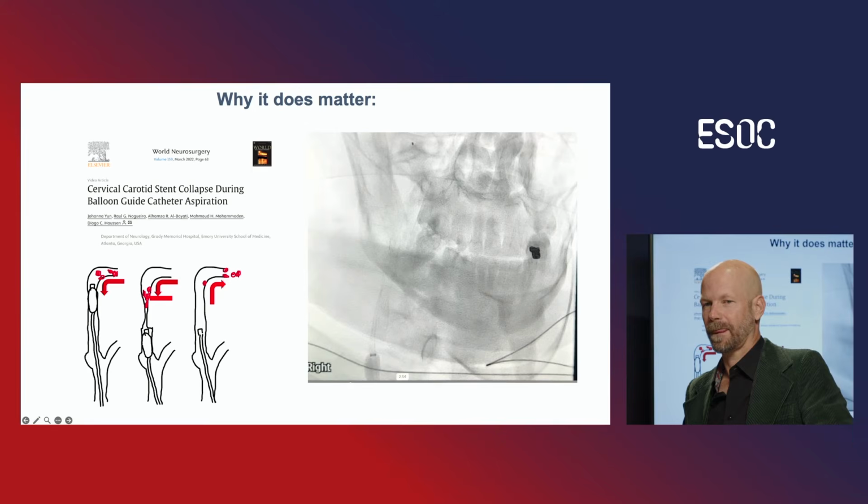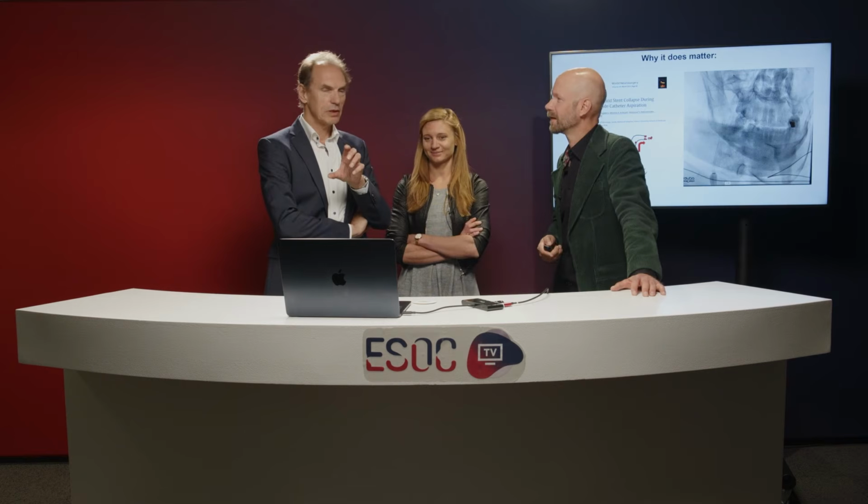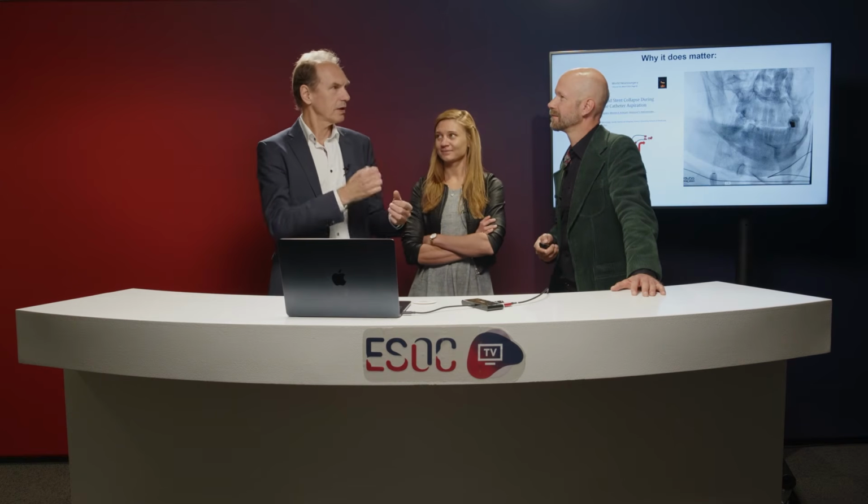Yeah, that's very well possible. I've seen a case once where a stent was in place already in the internal carotid artery, a wall stent, and they used a balloon guide, aspirated on it, and even the wall stent collapsed. So there's an enormous force when you aspirate, especially if you do it very proximally, it's quite evident that the vessel will collapse.